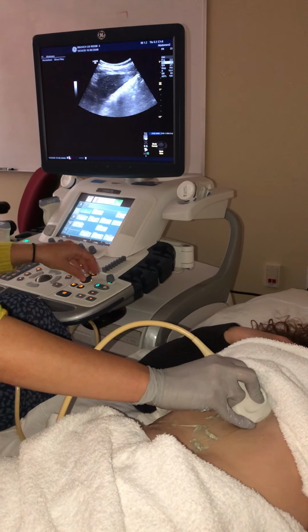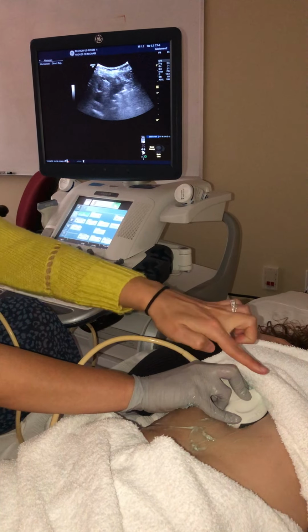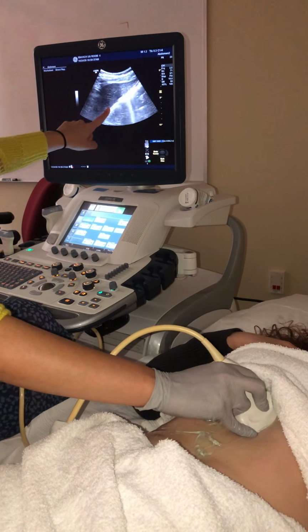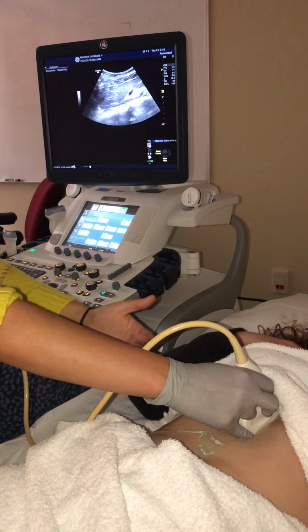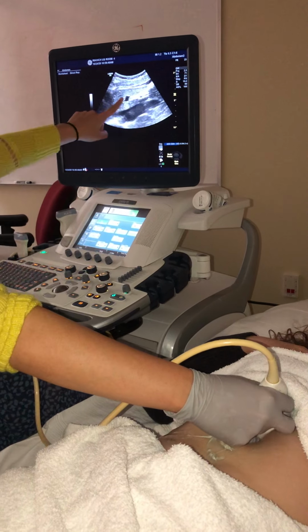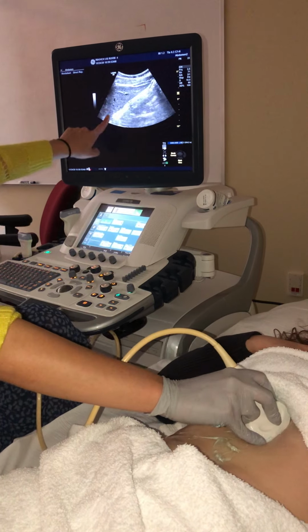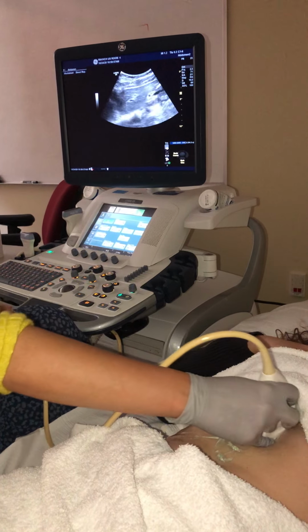So here I'm sweeping out to her left side. So I'm looking at all of this liver tissue that's heading that way to the left. And then I'm sweeping back in. I'm going to get back to that midline, and then I'm sweeping to her right side, getting more of this left lobe tissue, and then that is eventually going to put us into our right lobe. So our left lobe, just that small section of tissue, but we want to be sweeping left to right, making sure we get all of it.